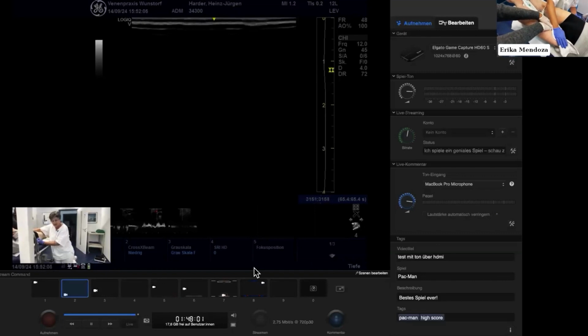And I was very impressed to see that there was really little foam in the common femoral vein. Normally, if you do the sclerotherapy, you see a lot of it. And this is because I used 3%. I stopped injecting when I saw it was there. And the vessels were really contracted by the adrenaline. Excellent. So that's it.